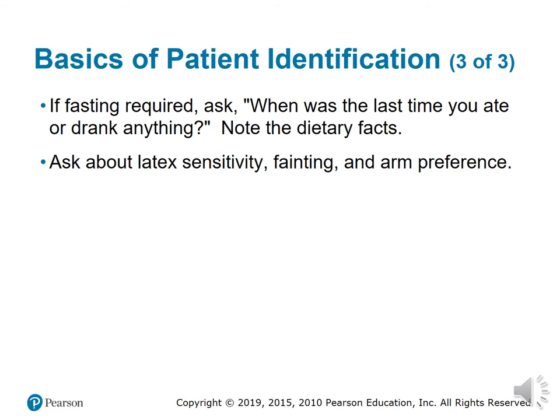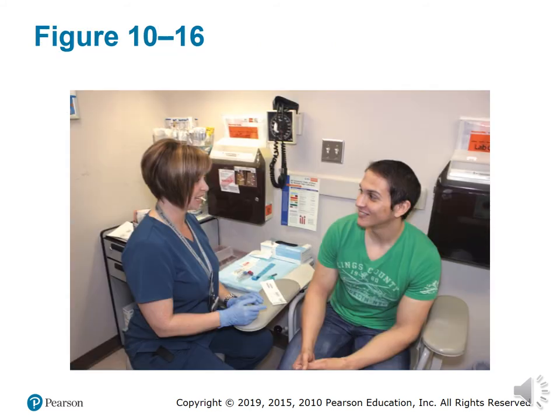Okay, if fasting is required, ask when was the last time you ate or drank anything. Note the dietary facts. Ask about latex sensitivity, fainting, and arm preference. I think we'll see that in the next couple pictures coming up. Right.